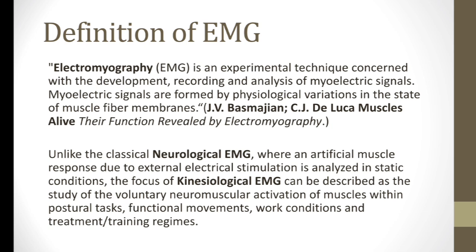So the focus of kinesiological EMG can be described as the study of voluntary neuromuscular activation of muscle within the postural task, functional movement, work conditions, and treatment training regimes.